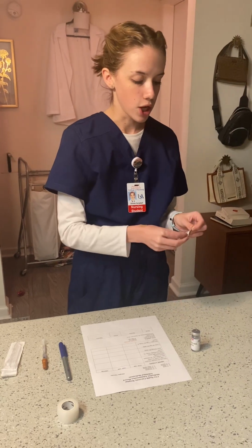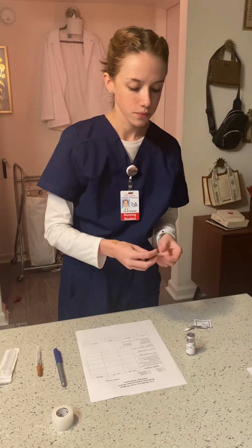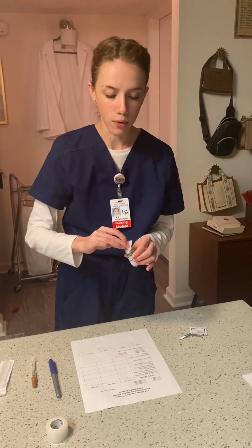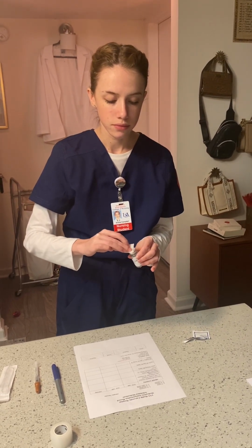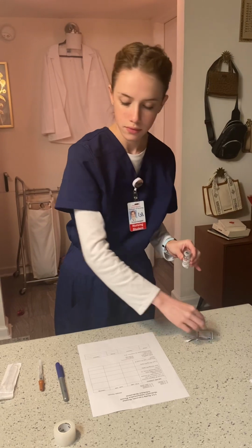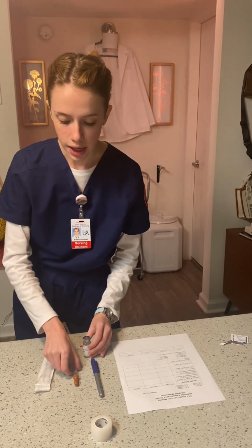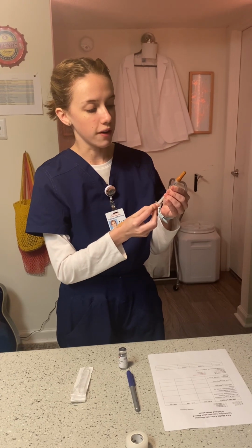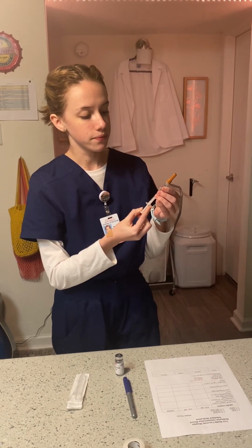So I'm going to open up an alcohol swab, and I'm going to clean the lid of my vial. I'm going to go ahead and take my syringe, and I'm going to pull 0.5 milliliters of air into it.